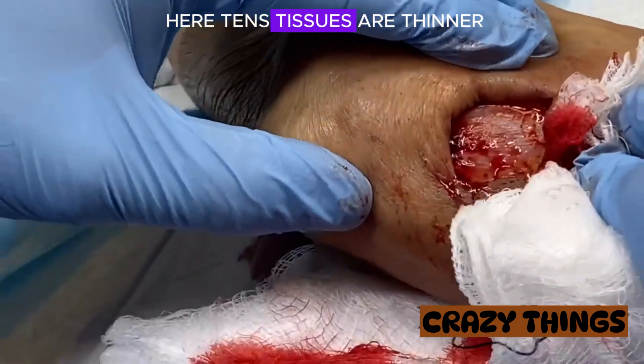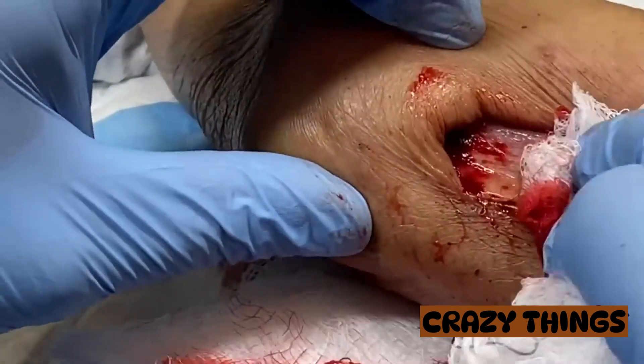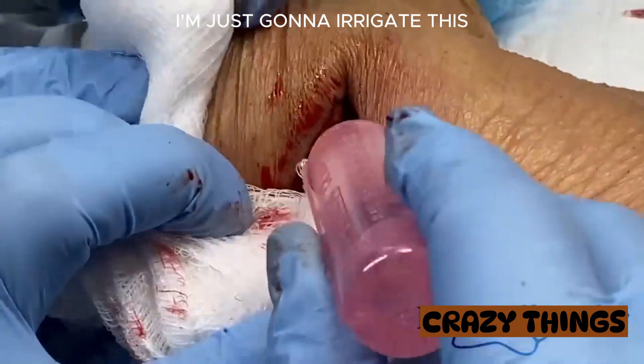You can see here where the tissues are thinner. Just above — see the tendons underneath there — that's just at the back end of the hypodermis. I'm just going to irrigate this.